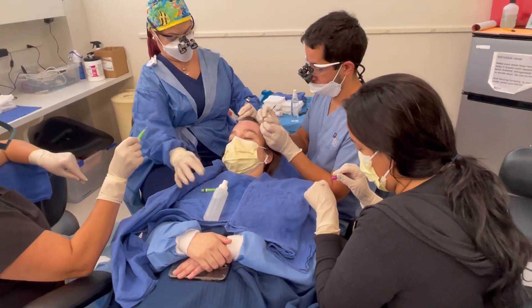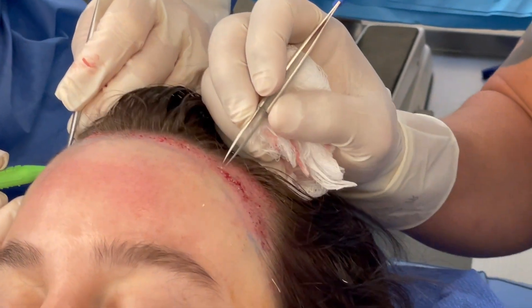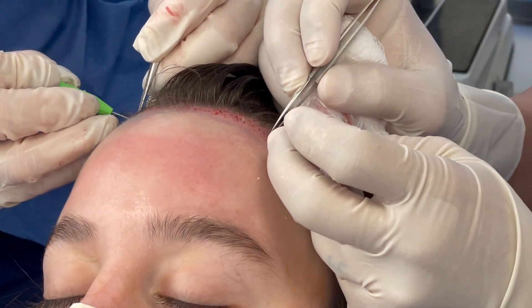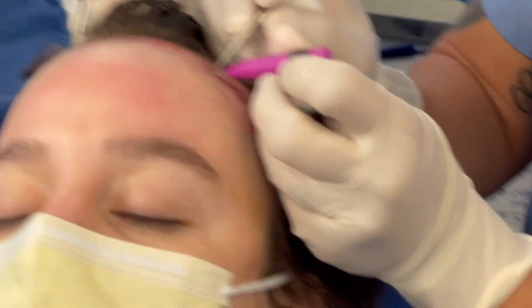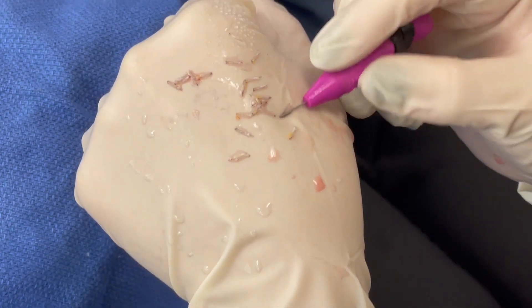Jose is planting pre-loaded implanters into the recipient sites. The advantage is that the grafts can be gently inserted. You can see Carmen is also doing that at the same time. Monica is loading the implanters and keeping the grafts moist.